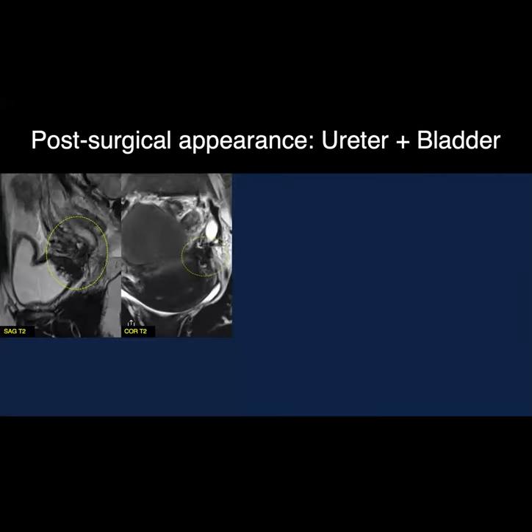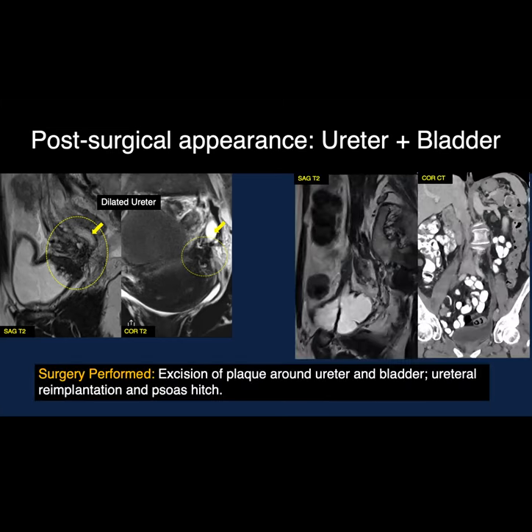Here a patient has urinary tract involvement by deep endometriosis. There are T2 hypointense plaques infiltrating the ureter and adjacent bladder wall, giving rise to hydroureter on the same side. Surgery involved excising these plaques involving the ureter and bladder wall. Because the plaques were extensive, the ureter had to be re-implanted with creation of a psoas hitch. On post-surgical imaging, you see distortion of the bladder contour and the shortened ureter now re-implanted at another site on the bladder wall.